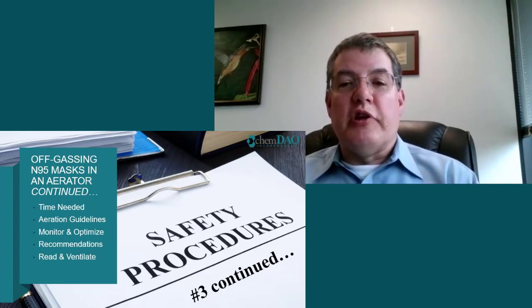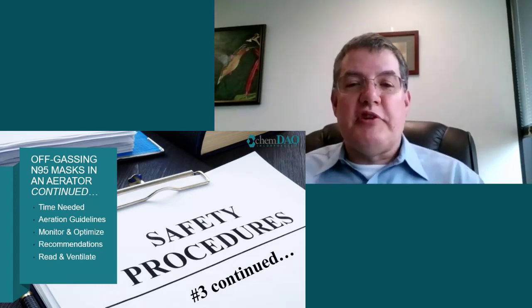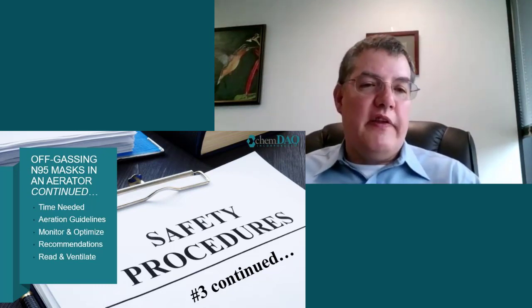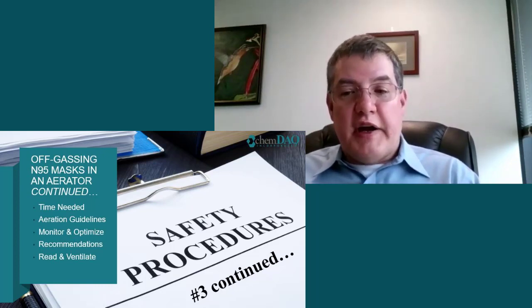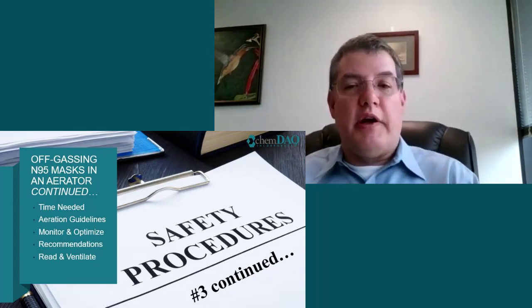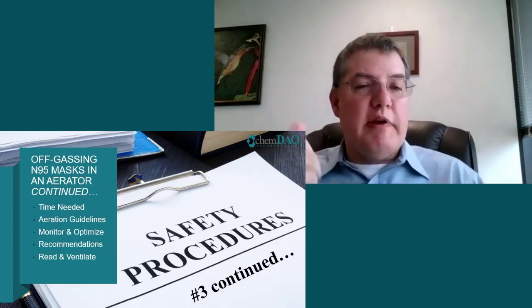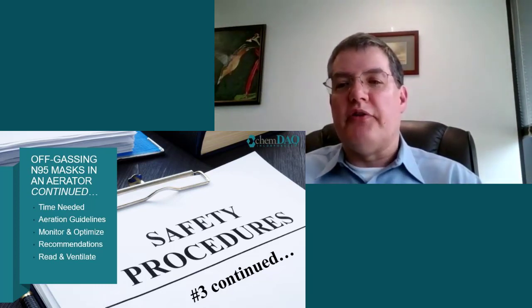It is recommended to use a monitor that has a separate wireless, e.g. Bluetooth, sensor that is connected to the exterior of the container, and a separate display where one can read the concentration. This is particularly useful in the examples we've talked about today, such as checking that the concentration inside a room after room fogging is low enough. You put the sensor inside and you can read the value outside. If we want to look at the off-gassing, we put the sensor in the box and we can read the value outside.